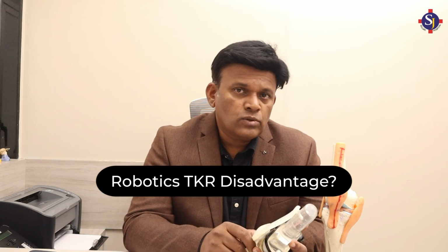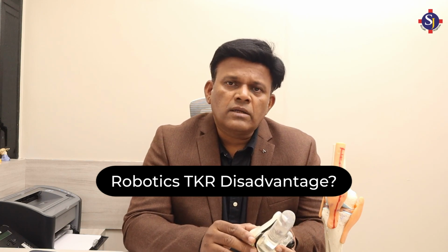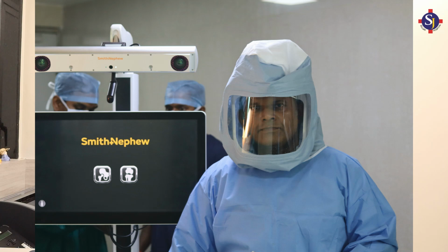There is only one disadvantage which I find, because we have done so many robotic surgeries now. The only disadvantage is, if you are untrained, then you had better call a trained robotic surgeon like us who can help you out with the knee replacement using robotics. Because if you are not trained, then the surgical time becomes almost double or triple, and then the patient can land up with other problems because of the increased surgical time. But if you are really trained, in fact, robotic knee surgery is faster and better with precise cuts.